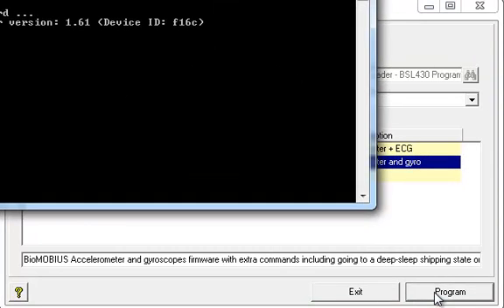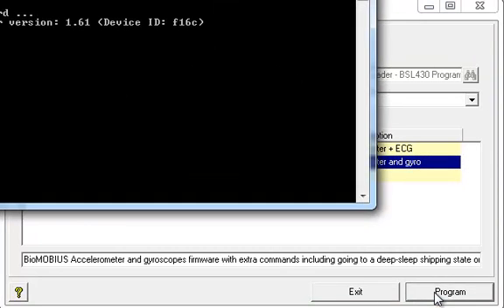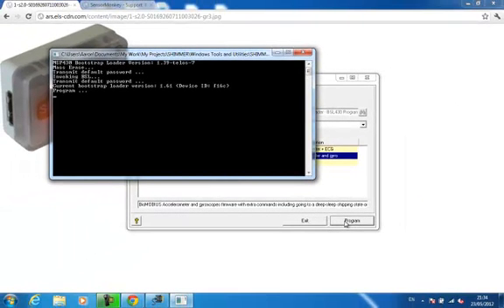After selecting the firmware and clicking Program, the process takes a short amount of time to complete.